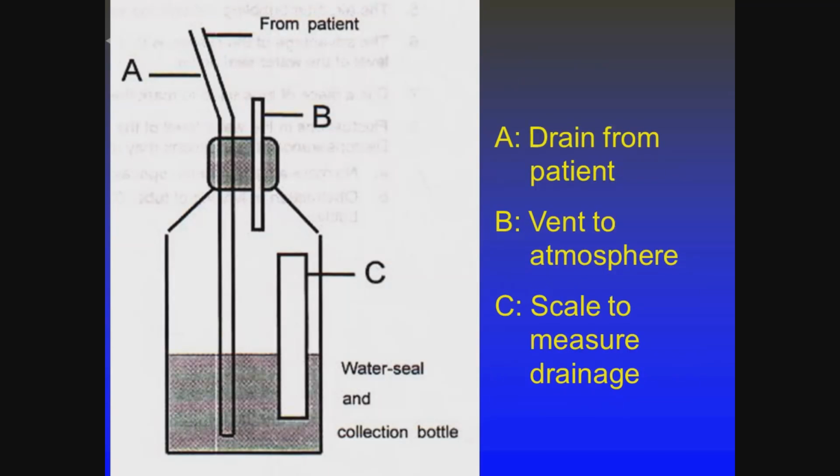So here I have a one bottle where I just have a tube coming from the patient. It's submerged below a level of water, and I have a vent to the atmosphere, so when this bubbles out, it's evacuated out through that mechanism.